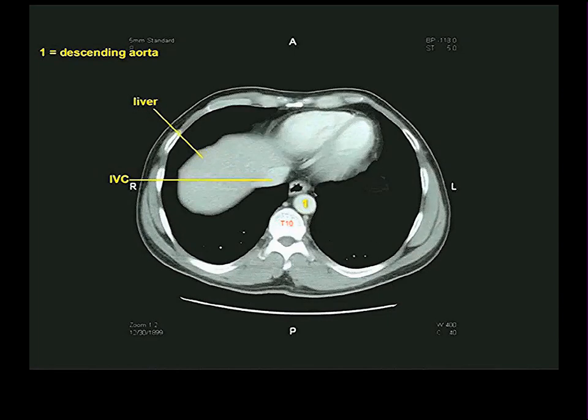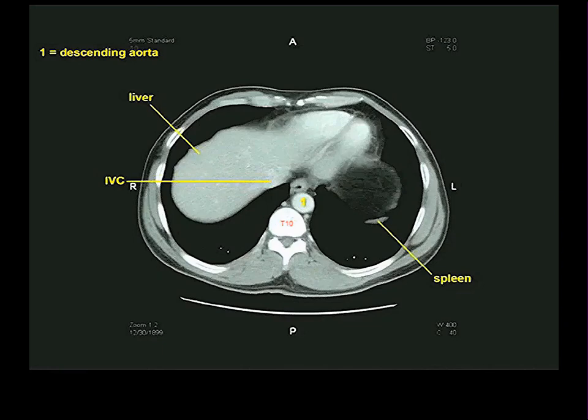And then it looks like the inferior vena cava disappears. But the inferior vena cava doesn't disappear. It just looks that way. Why does it look that way? It travels on the posterior side in the liver. That's true, and why does it look that way? I guess the water density would be the same. Yes, excellent. These are two water density structures.